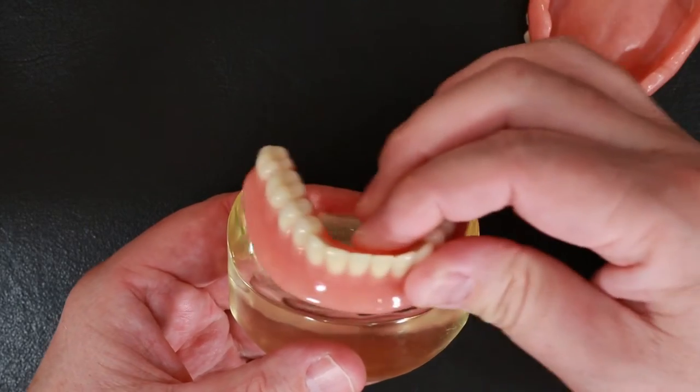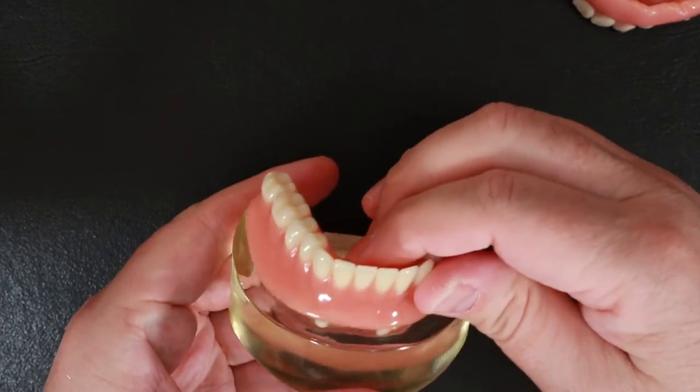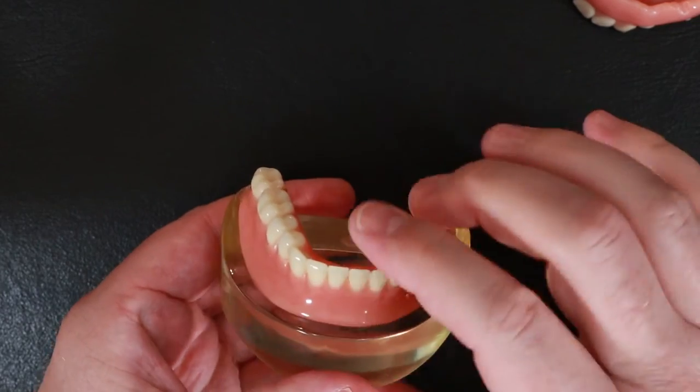To get the most life out of your snaps, don't bite your denture into place. Place it in your mouth and push straight down over where the snaps are with your fingers. Ask your dentist to show you how to do this. By pushing straight down on the snaps, they will engage the implant posts smoothly with less wear. Biting the denture into place can push down on the snaps unevenly or at an angle, which will cause them to wear out quicker.